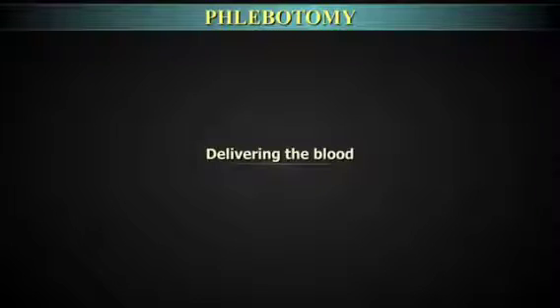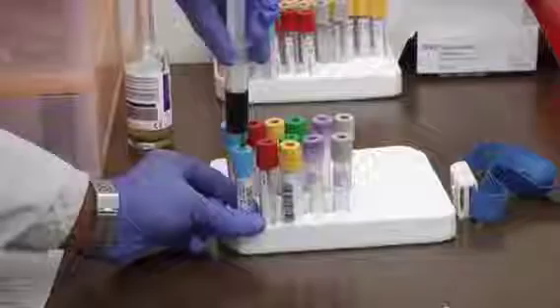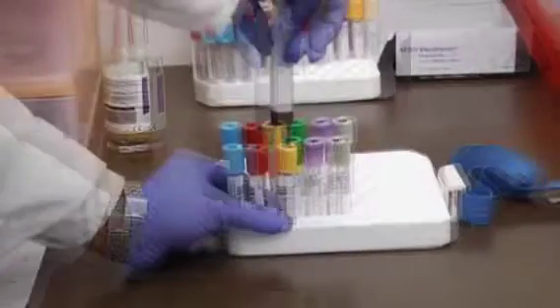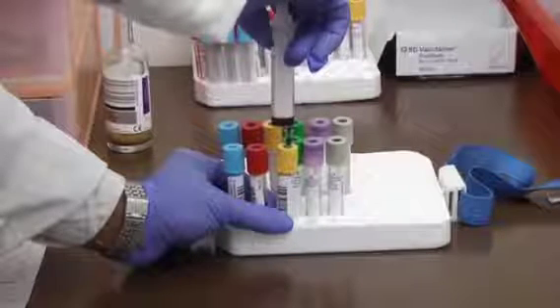Delivering the blood. Deliver carefully into respective tubes as per requirement for the test ordered and in proper order, which shall be discussed shortly.